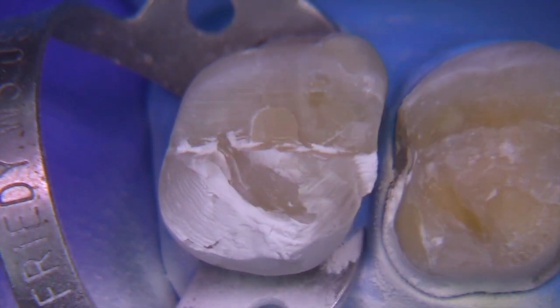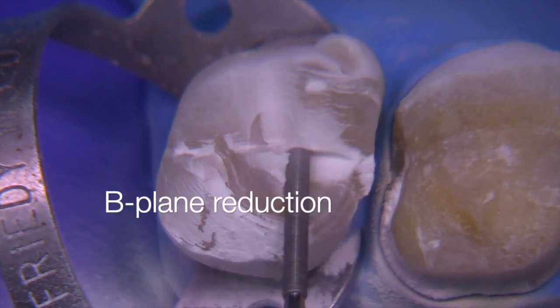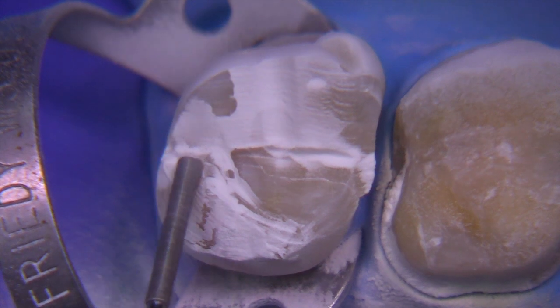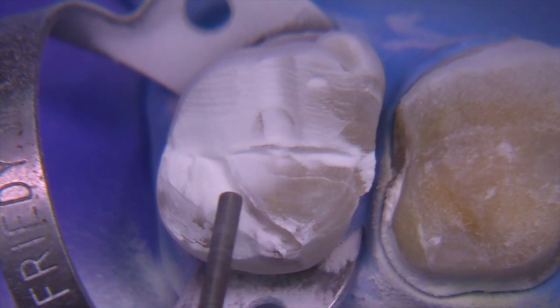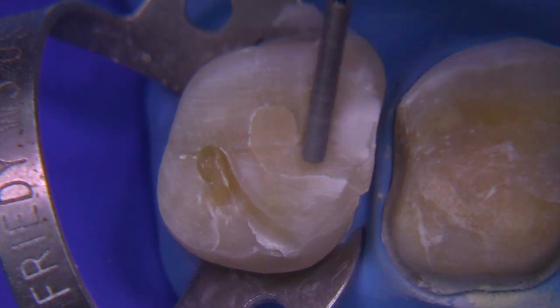With zirconia we can be more conservative but we don't want to be less than one millimeter — we really want to try to get 1 to 1.5. A significant amount of work has been done in this area by one of my friends Tassir Suleiman. He's at University of North Carolina and he and I converse about zirconia all the time, and it's just being abused a bit right now by being made too thin. We need to get a little bit thicker.